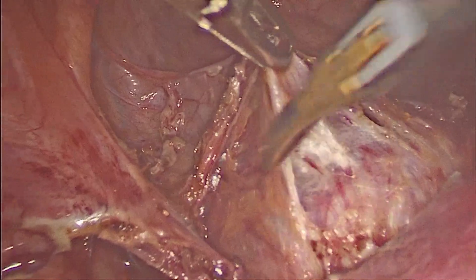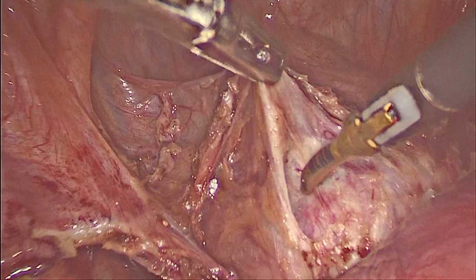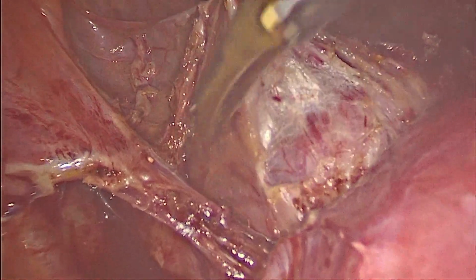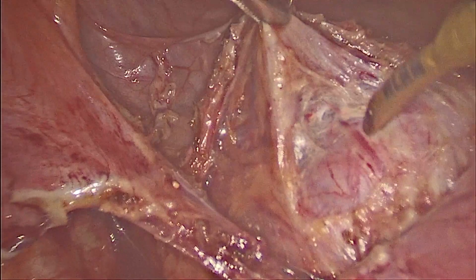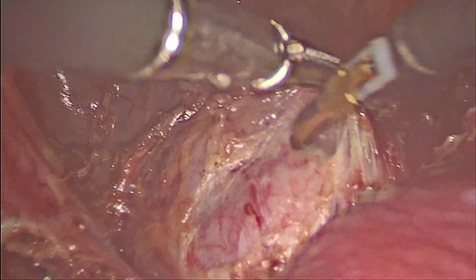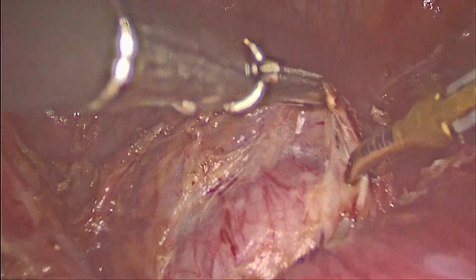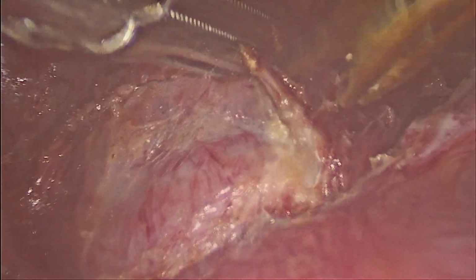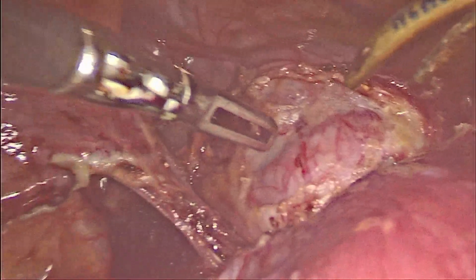If we do the dissection in this proper plane, definitely the amount of blood loss is very little. There is a proper avascular plane between these two, which needs to be explored before dividing the uterine veins and uterine vessels.